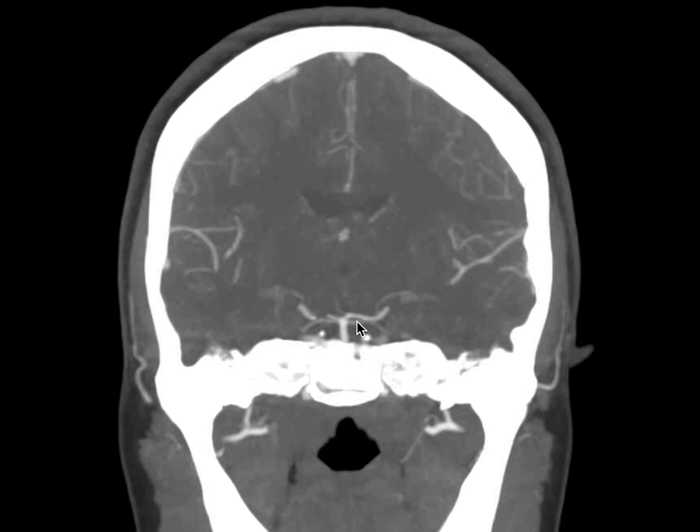In all these variants, it is important to look for how aneurysms may develop differently because of different bifurcation points. When a patient has an aneurysm, there's a 30% chance they'll have an aneurysm elsewhere, so always continue looking. This concludes our discussion of cross-sectional neurovascular imaging.